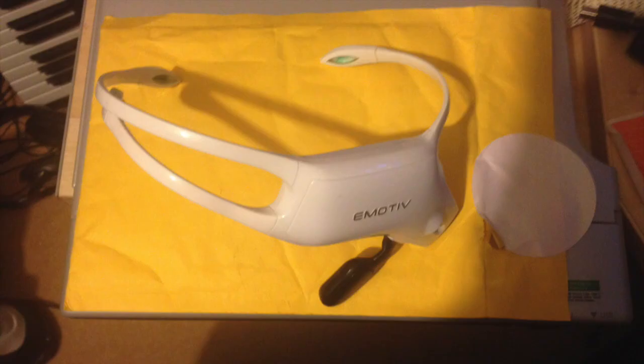Hi there, this is FixedIt. I recently picked up a broken Emotive Insight EEG headset on eBay and I wanted to see whether or not it would actually switch on, but unfortunately it didn't come with a power cable.